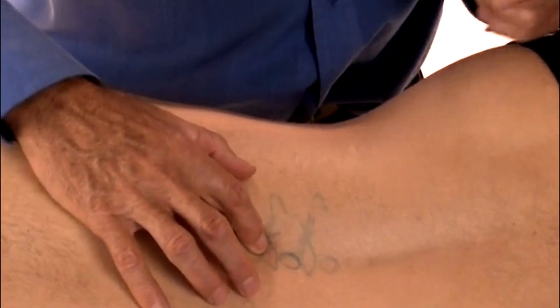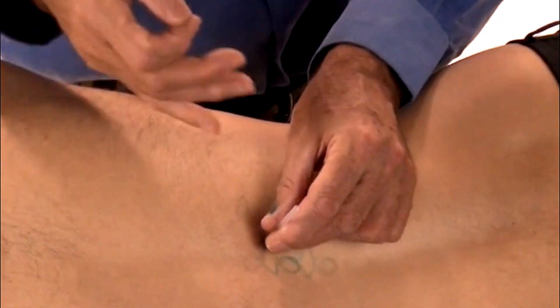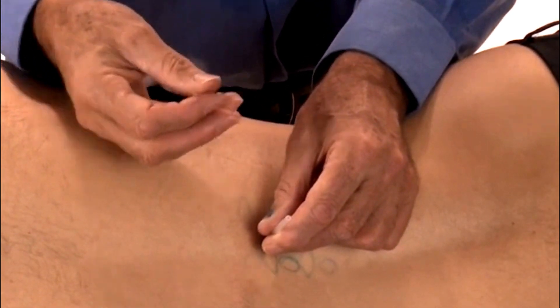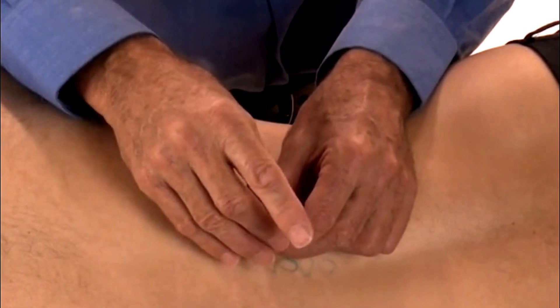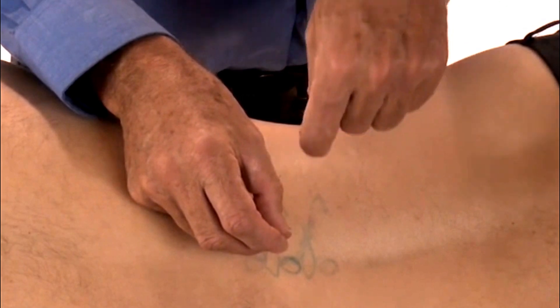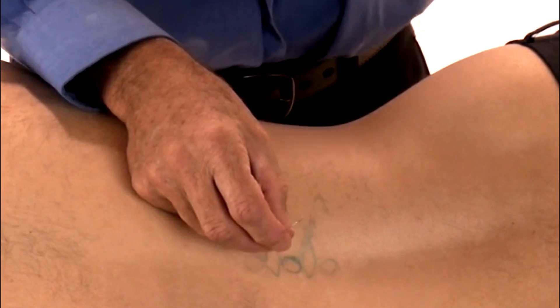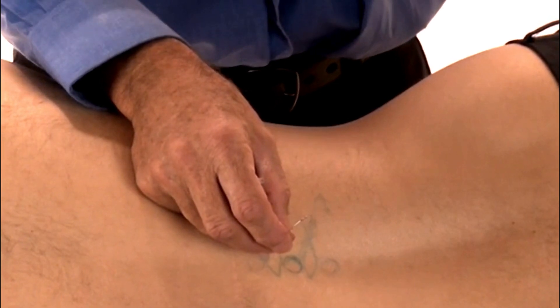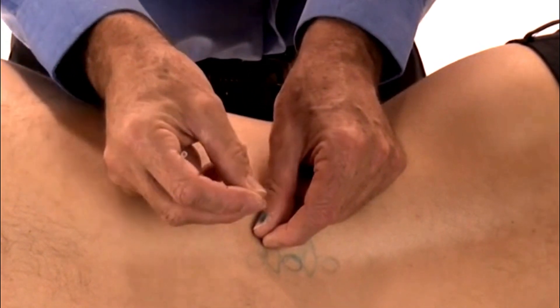Having found the trigger point using the technique we spoke about, I come a finger breadth to the side, put my introducer, and angle ever so slightly away from the midline — again, just to give a little bit of safety. I tap the needle and as I go down, I'm going through layers. I've primed the patient to say when he feels the point — a pain or a little electric shock — and I'm feeling for needle grasp, a little firmness as I move through the muscle layers.